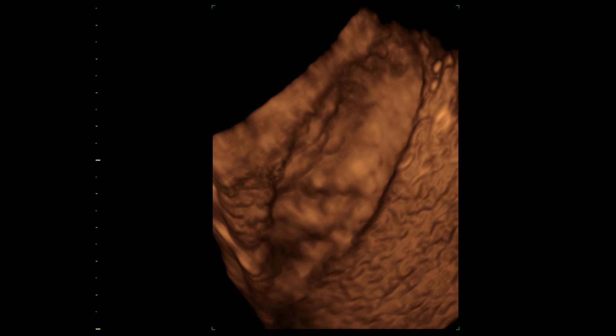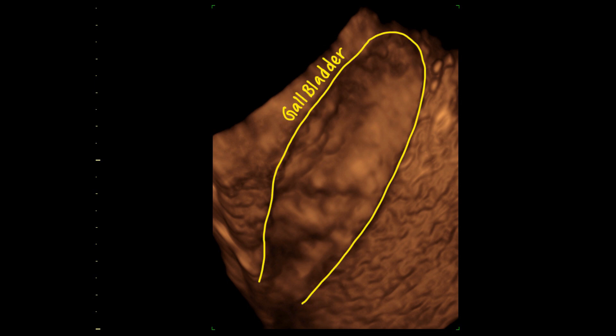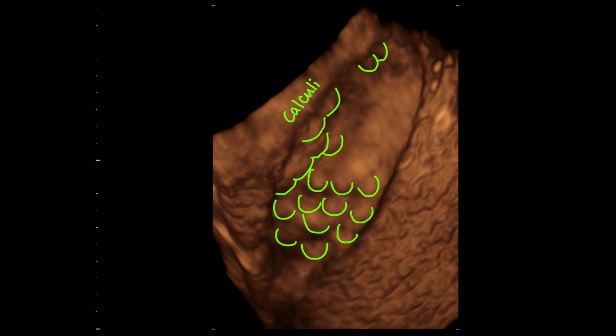Here you can see a poor quality three-dimensional ultrasound image of the gallbladder lumen. The indenting parts are calculi within the lumen.